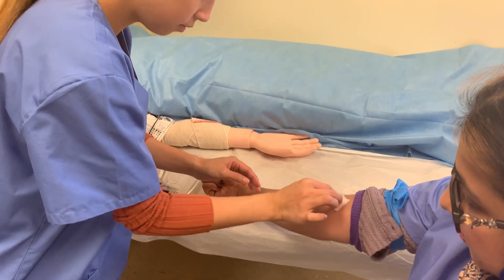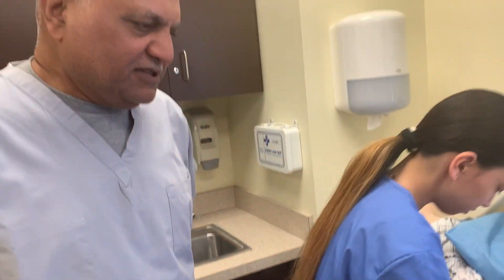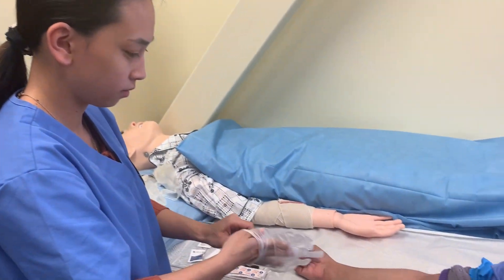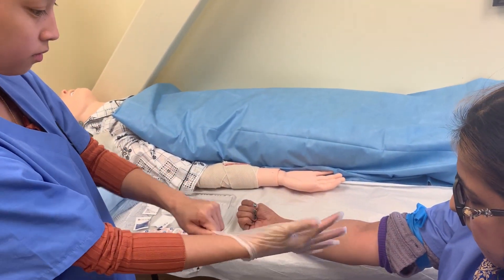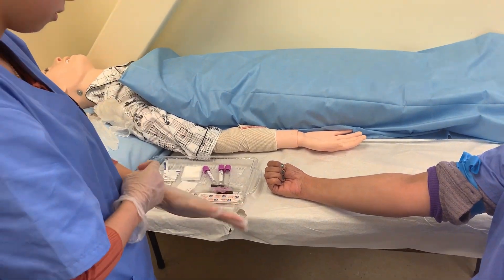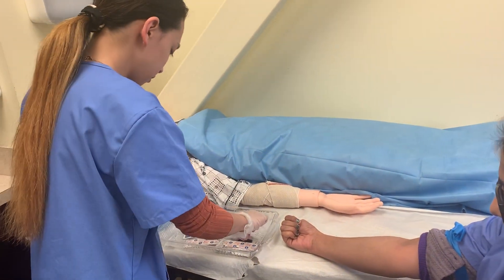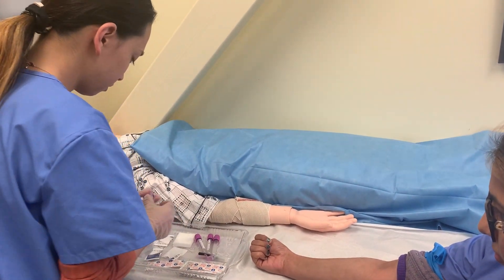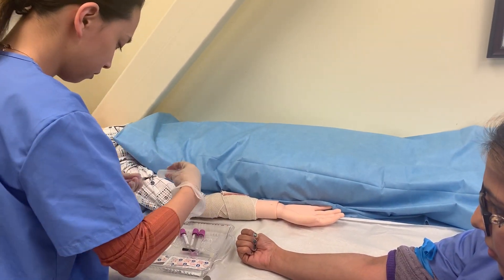The MA student performing the phlebotomy procedure: tie the tourniquet, clean the site with alcohol, allow it to air dry, and once the site is dry you can perform the venipuncture.